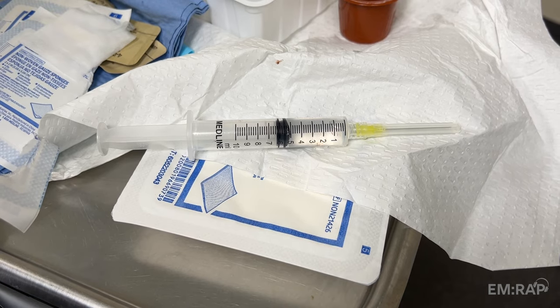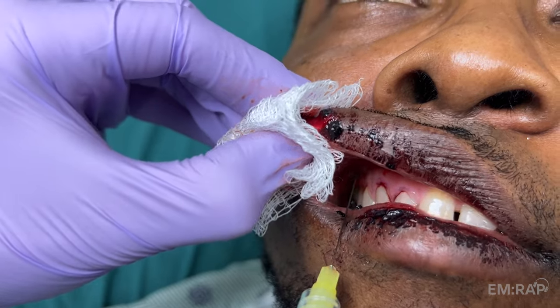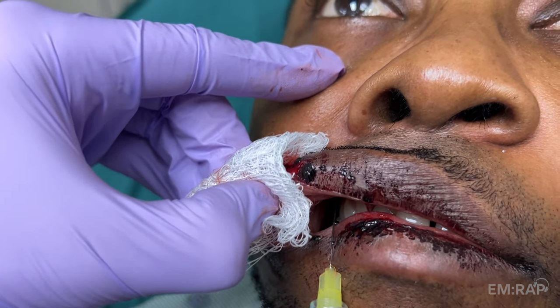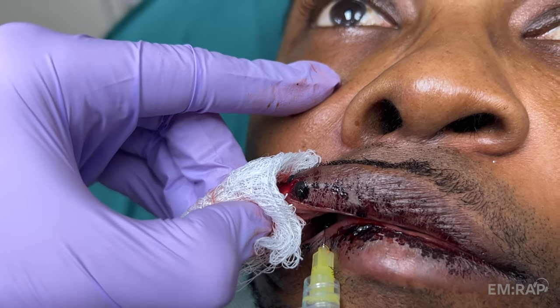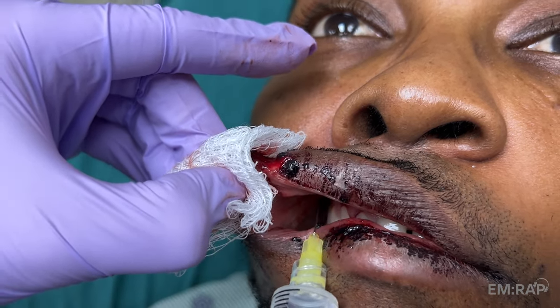Using a 25 to 27 gauge 1.5 inch needle, insert it through the mucosa of the second premolar — that's the fifth tooth over — and aim up to the foramen, which is about 2 centimeters from the mucosa. Aspirate and inject 2–3 mLs of local anesthetic.